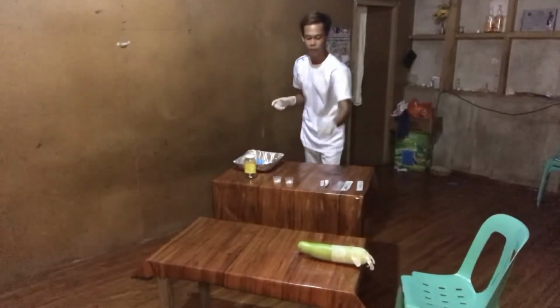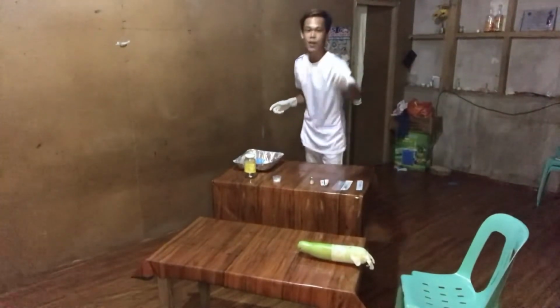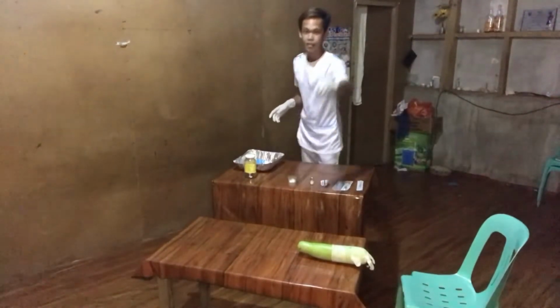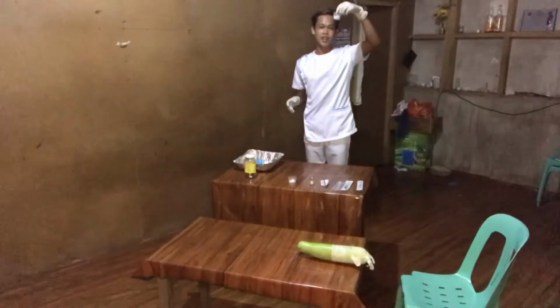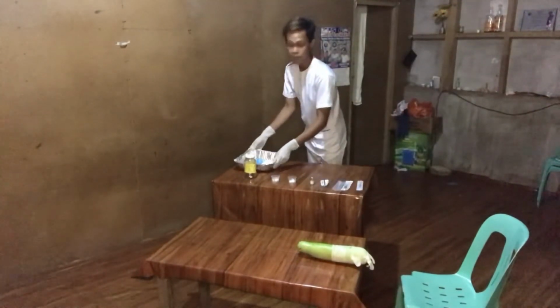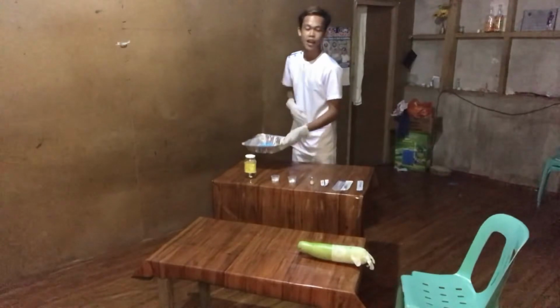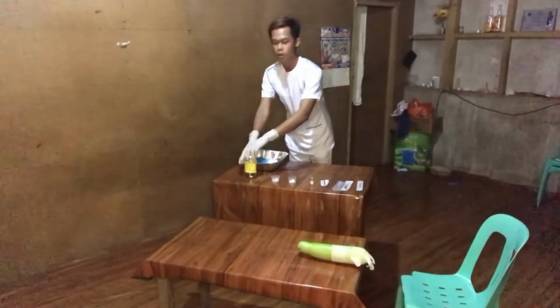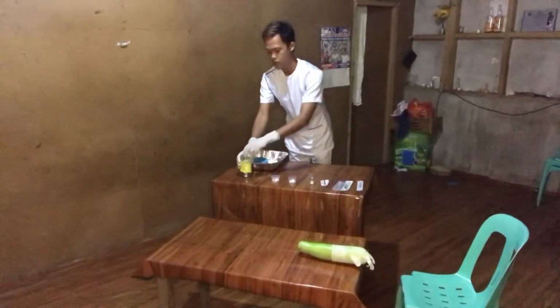We also have cotton balls, one soaked with alcohol and the other just dry cotton balls. We have the hypodermic tray, and last, the waste receptacle where I'm going to dispose used needles.